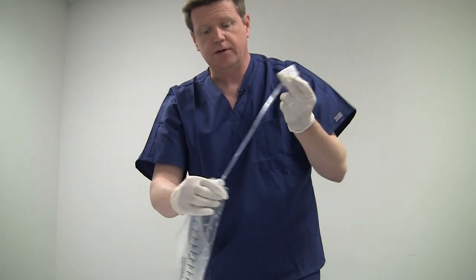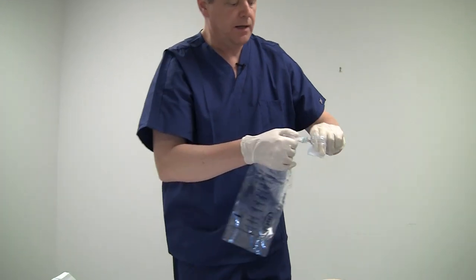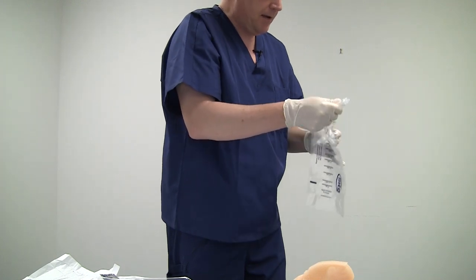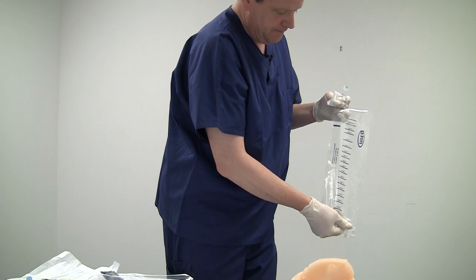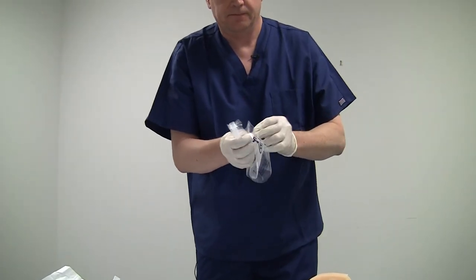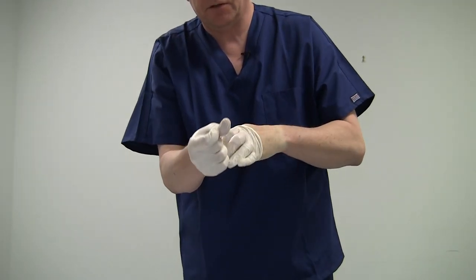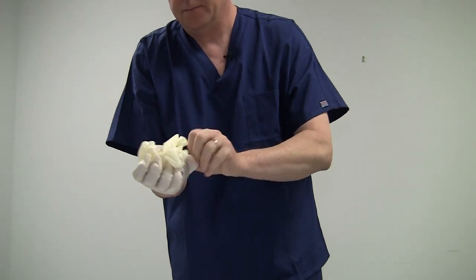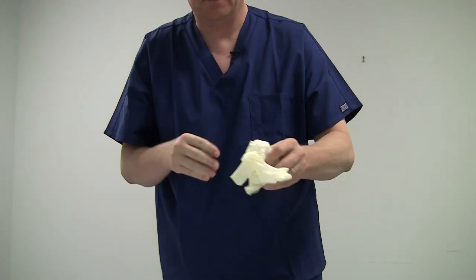Use the gauze tissue, entwine the catheter. Go over to the toilet, look away, pull the catheter out the top of the bag. And we have finger holes here too, which can be used to help drain the bag. Finally, when you're all finished, take everything in one hand, take your first glove off, your second glove off, and you never come in contact with the patient's fluids either.